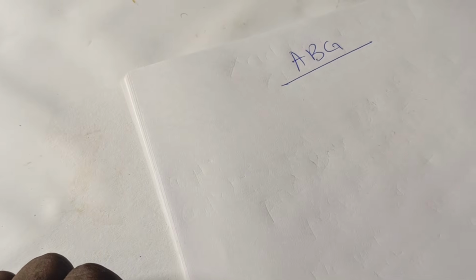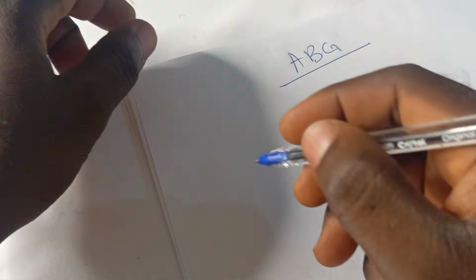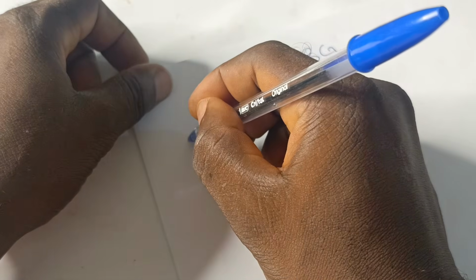Now, ABG is a test that is done to ascertain acid base balance and also gaseous exchange in the body. So I'm going to talk about very important values here, which are the components of the ABG. And for interpretation of acid base, we are interested in a major first three of it.